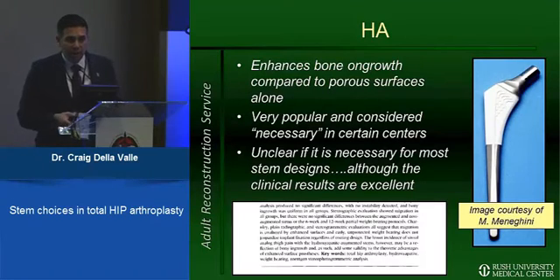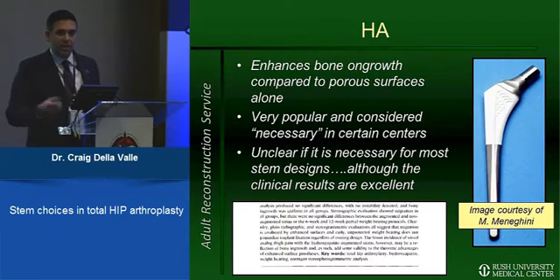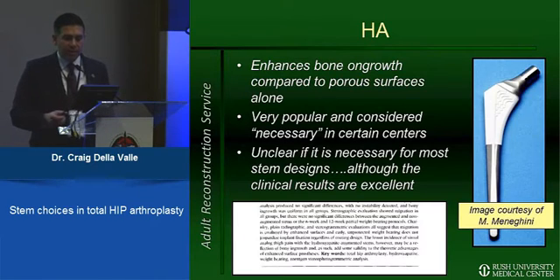Real briefly, I wanted to touch on hydroxyapatite. I think the long and short of it is that in some centers this is considered necessary, in other centers it's not. And it's unclear if in most modern iterations it is necessary. Although the results with these types of stems are excellent, the addition of hydroxyapatite in most cases does add to the cost of the implant.